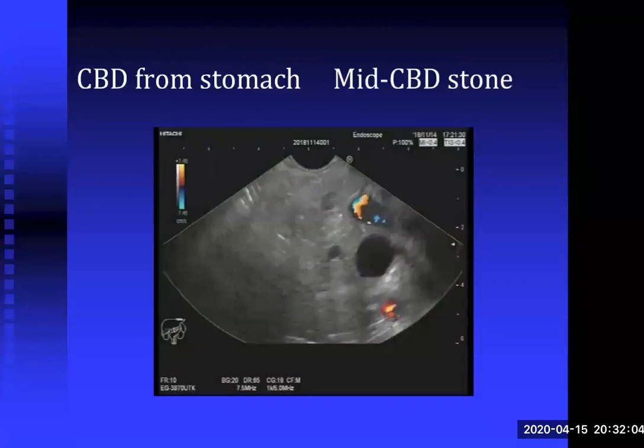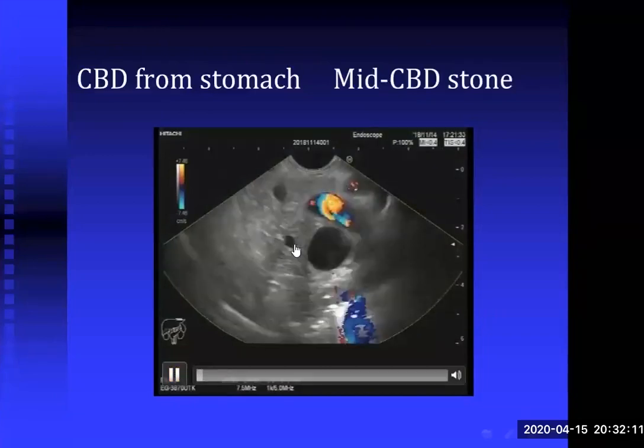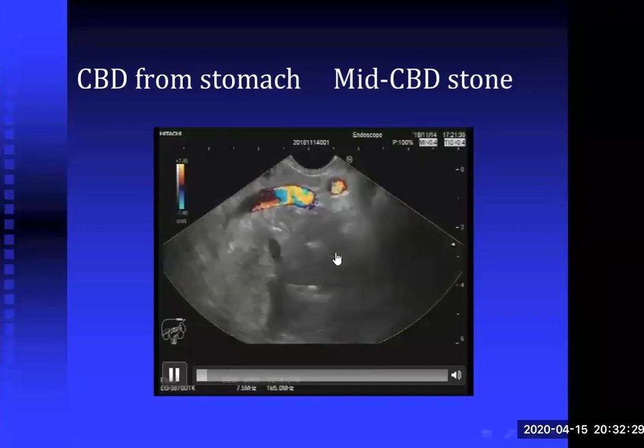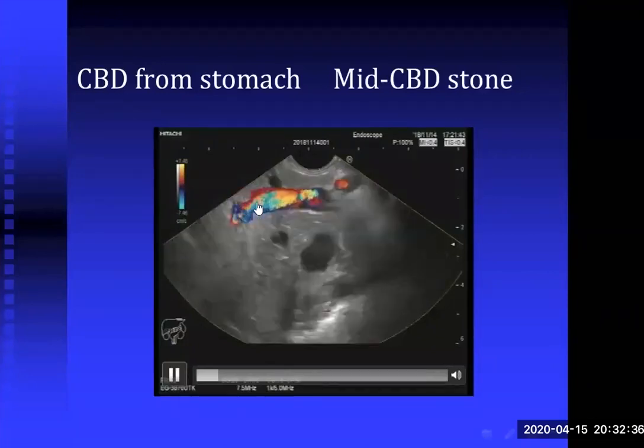This is a pathological lesion seen in this station. Now we are in the same station. And this is the superior mesenteric vein. And this is the pancreatic head. And this is a very wide structure. No signal inside. Actually, this is a dilated common bile duct. It is, I think, more than 1.5 centimeters. So it is pathological dilatation of the common bile duct, and this is the pancreatic duct. And this is the superior mesenteric vein.